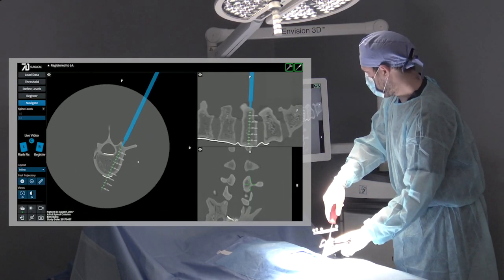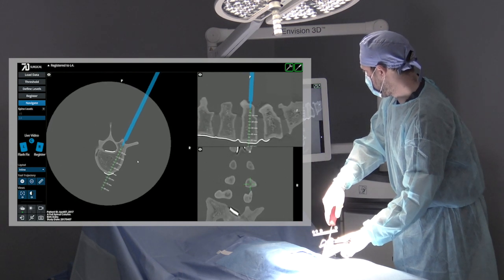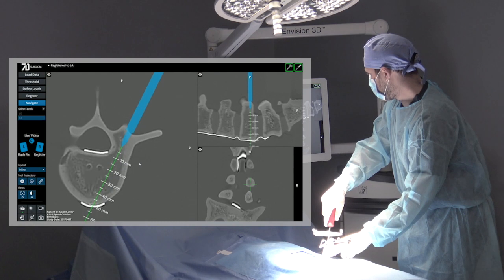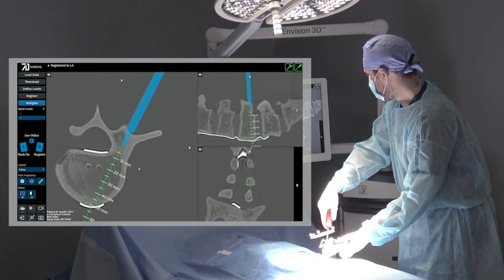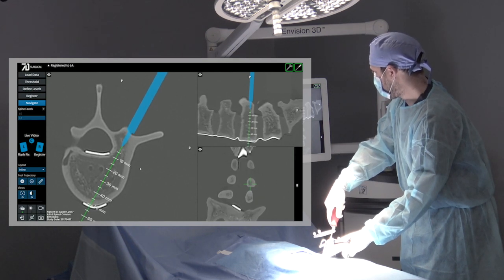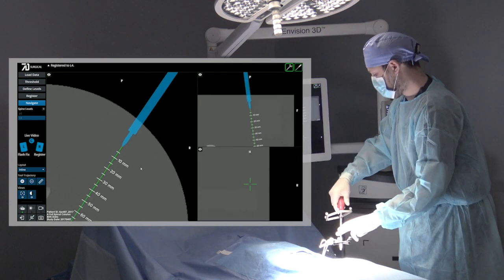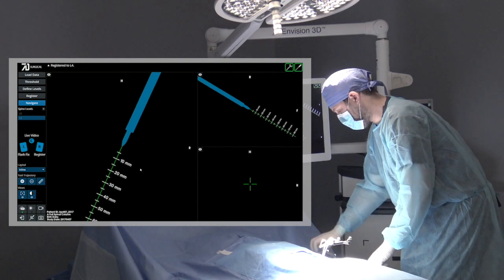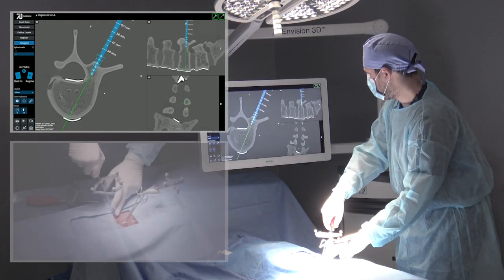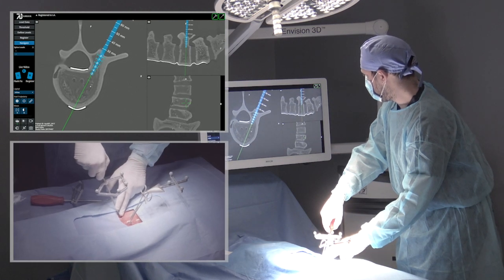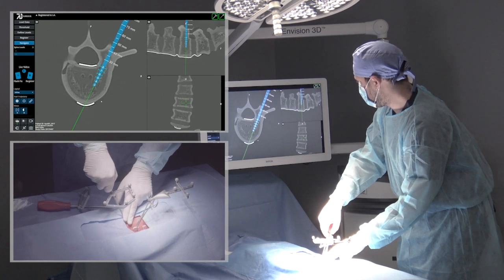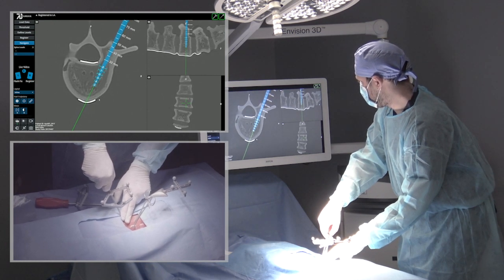Once the surgeon is pleased with the registration, a foot pedal press advances the software to the clinical views. Using the tracked awl, the surgeon can plan the screw trajectory and create a pilot hole. With 7D's real-time implant sizing, the surgeon gets accurate feedback on optimal screw length using the measurements displayed on the software. Similarly, once the pedicle probe is inserted to create the screw track, width and length measurements are displayed simultaneously so the optimal implant may be selected.